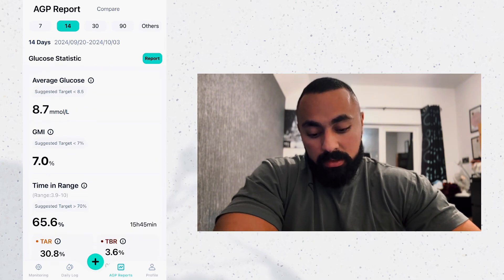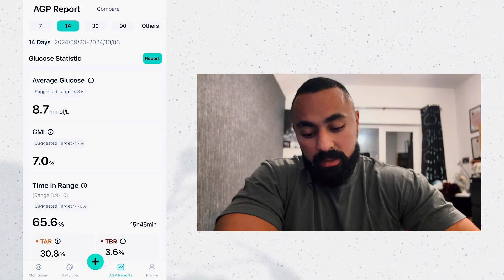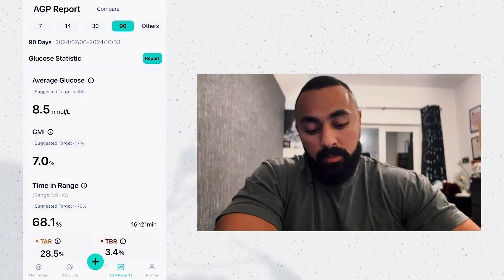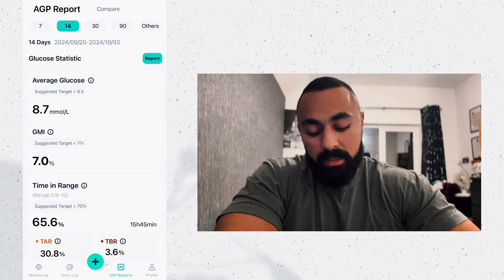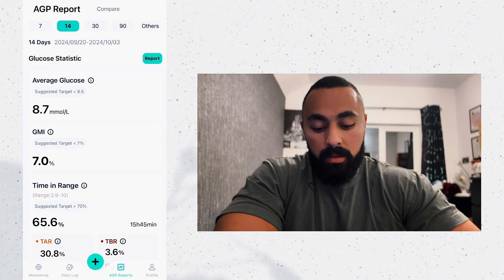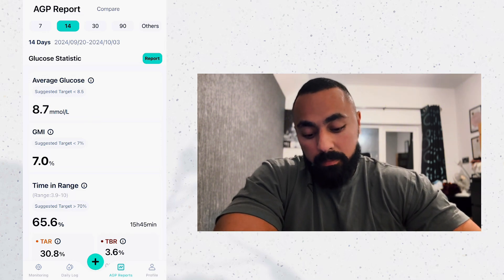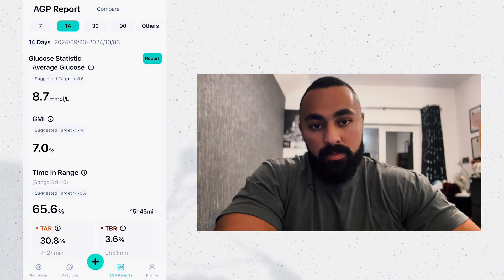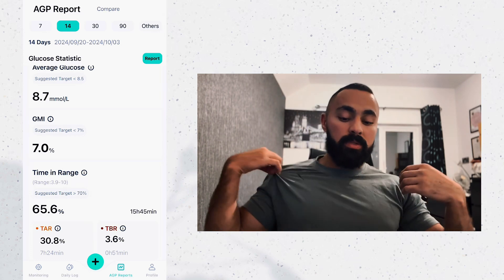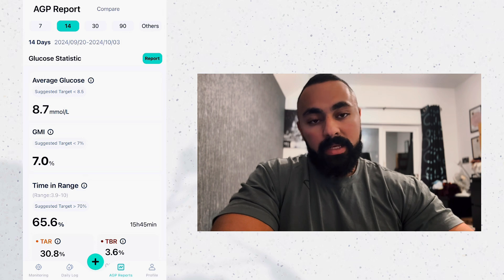Skip the plus sign for now — let's go to AGP reports. Scroll up and what you see here are the averages. This shows the past 14 days; you can click 7, 14, 30, or 90 days, or even a customized period. Within the past 14 days my average blood sugar was 8.7 millimoles per liter. The app advises it should be under 8.5. I'm fully aware, because I know my average should be between 5 and 7 millimoles per liter.